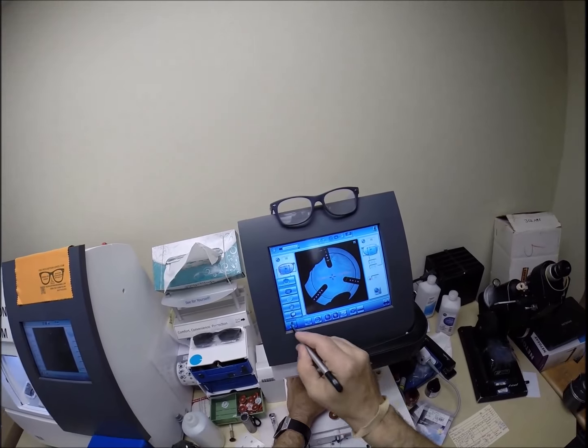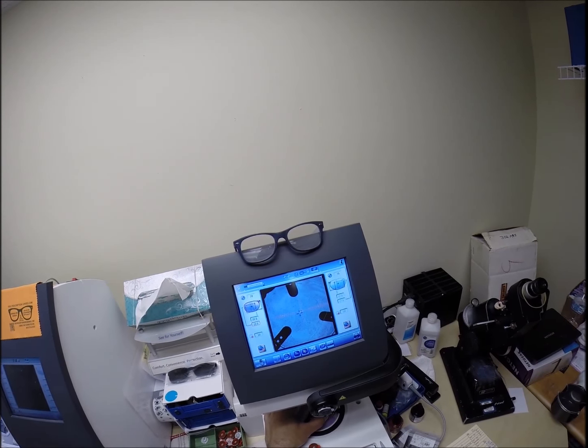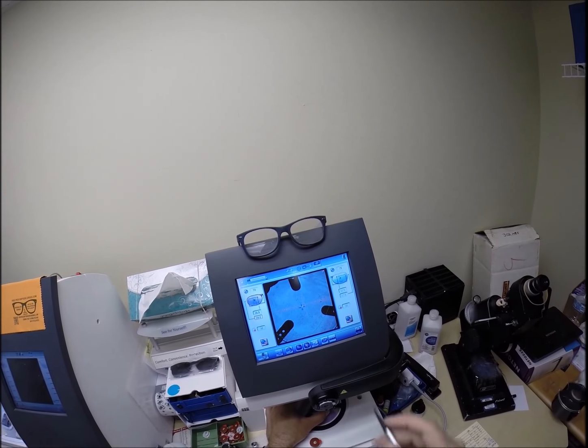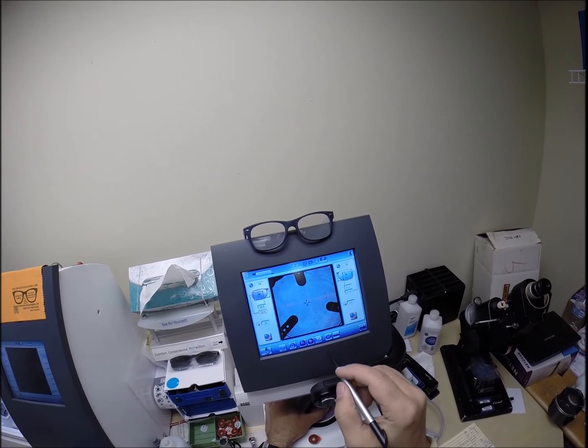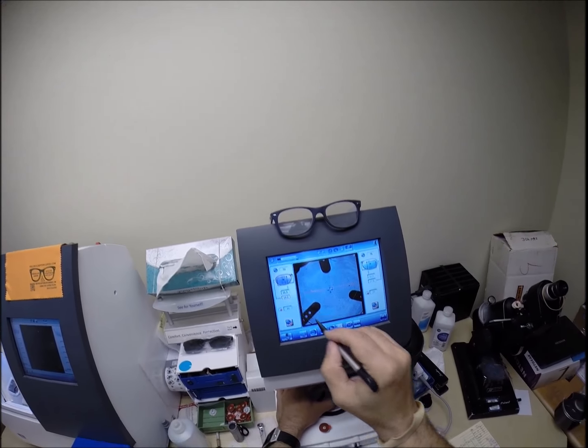That is looking, oops, hang on, that's not that. That is looking good. Line everything up where it's supposed to go. And those dots out, the blue cross is the geometric center of your frame. Your eye is just above that in inset. So we're getting everything lined up.